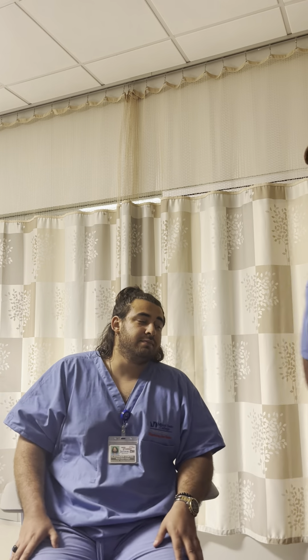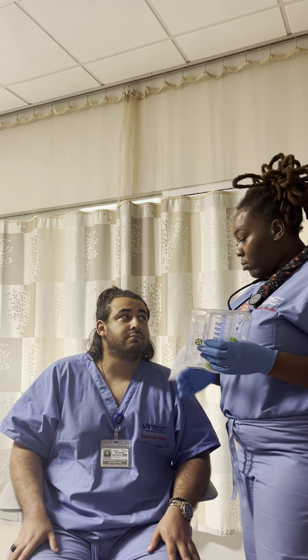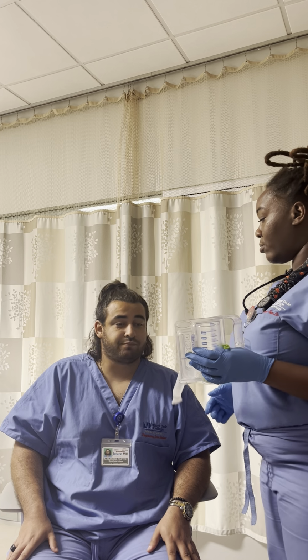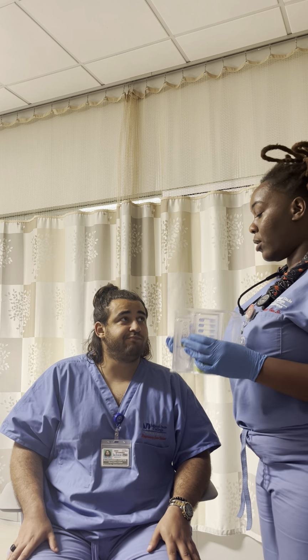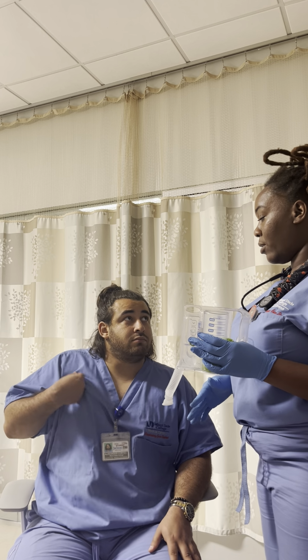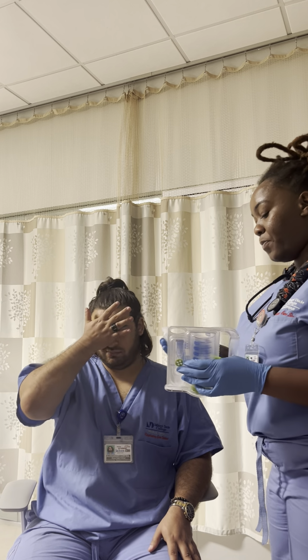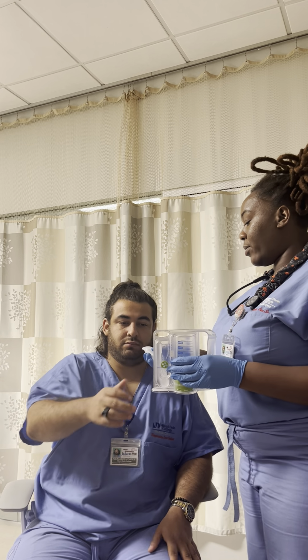Now we can begin, okay? So, now, exhale normally. When you are inhaling this, slow, deep breaths, okay? Don't try to go too fast, too slow. Just nice, slow, deep breaths, okay? Put your mouth around the seal.